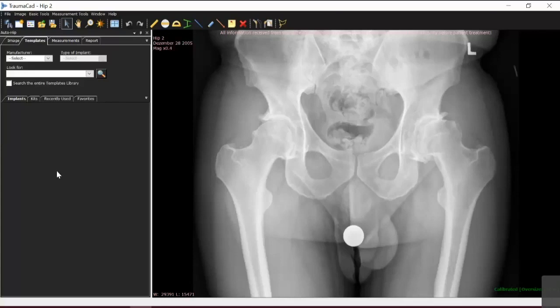That's a very good question, once again. As the market evolves, we find, particularly in the European market, that not for every case, but for more complex cases, 3D does add value preoperatively. There's no question about that. To go into a little bit of the history of BrainLab, we are very skilled in intraoperative navigation.